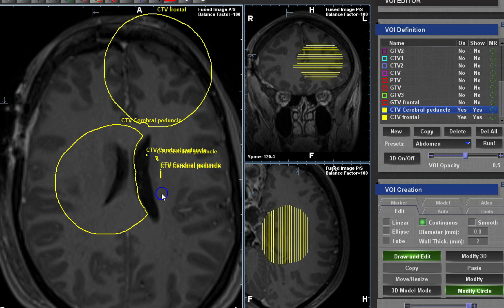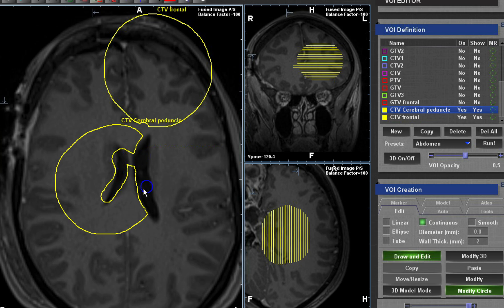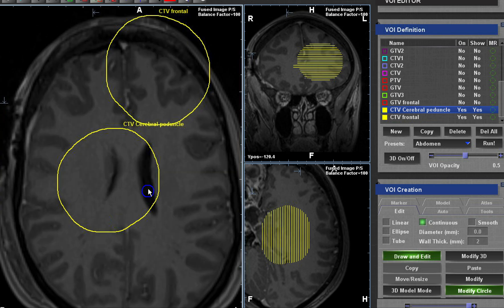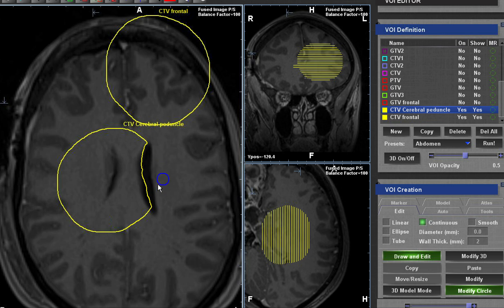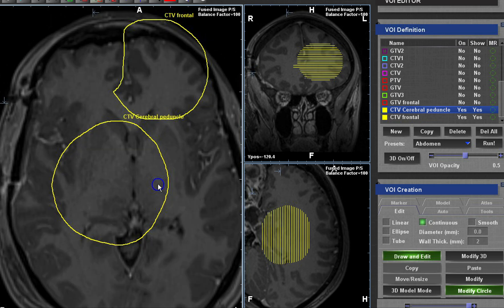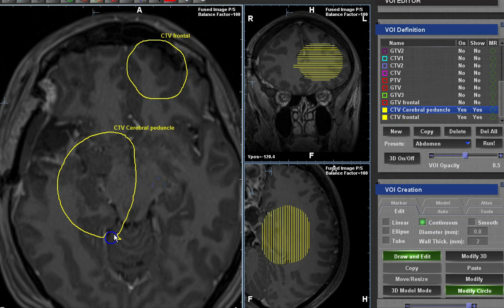It is very difficult to do sophisticated trimming around the ventricles and at the end of the day the area will be covered when you look at the dose distribution. I usually give a margin around the sub-ependymal tissue if there is a tumor around the ventricle, but you don't have to if you want to stick to the guidelines. Both approaches are valid since we have both EORTC and NRG guidance — use whichever you prefer.